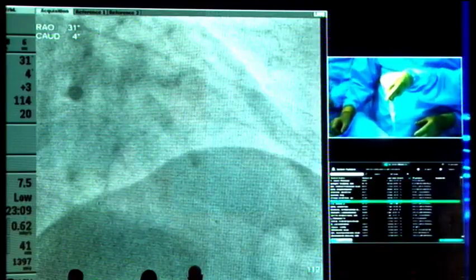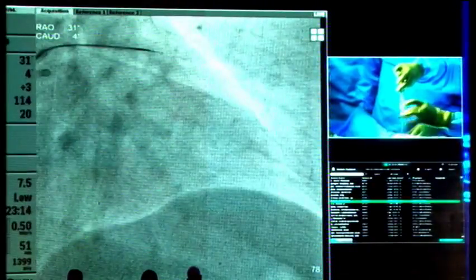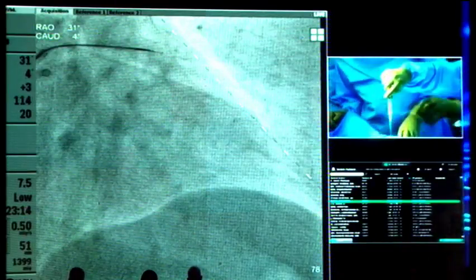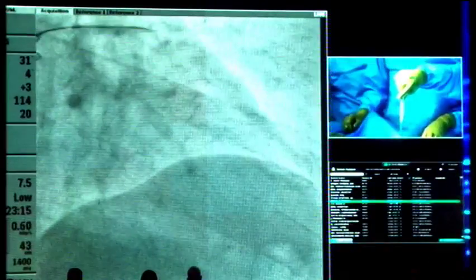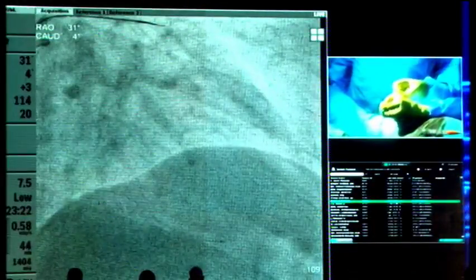So we come back a little bit more proximal. Now it's okay. Yep. Sometimes we have to wait 5 minutes, but we don't have enough time. So the blood is coming. Okay. So no more silly things. Okay, we try to take it.